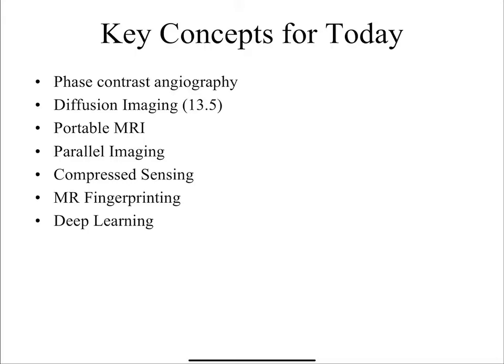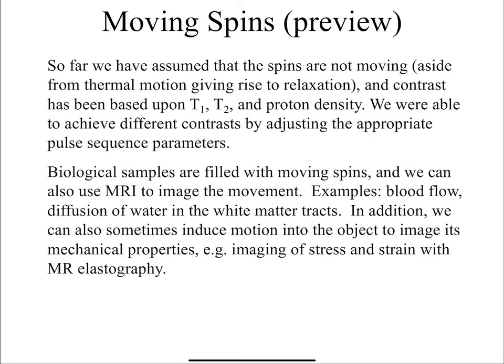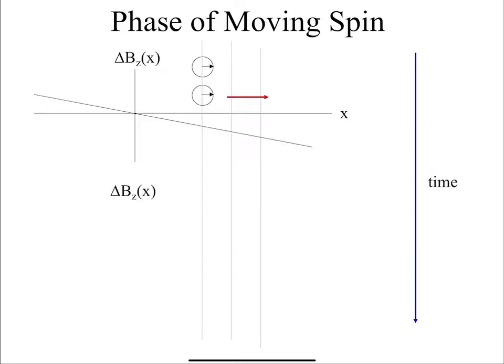Okay, so with that introduction, the concepts today are just good for you. All right. So what we're going to talk about is more advanced MR, things that you'll probably see if you get into MR more, or things that you're going to see in the future. So the first thing we want to talk about is what happens when spins move.